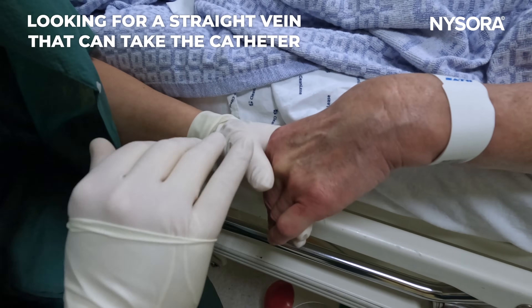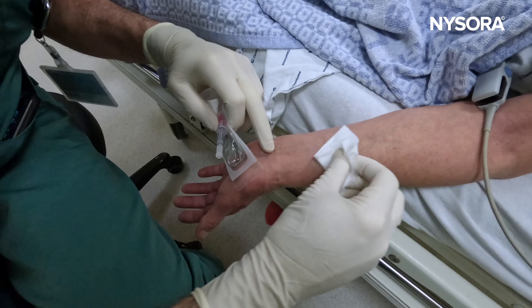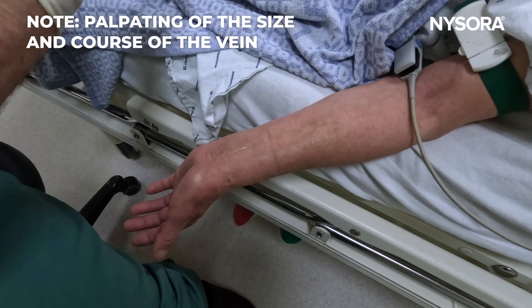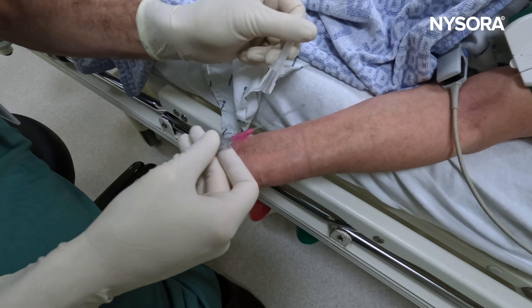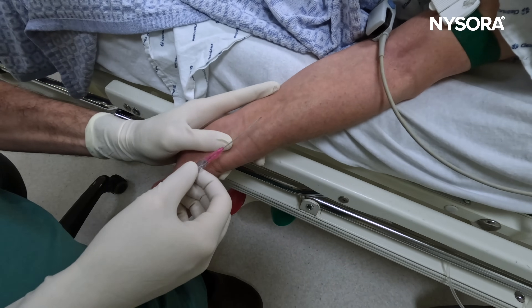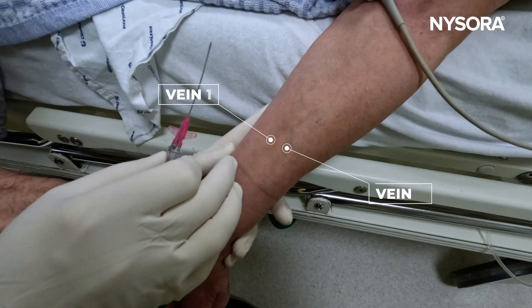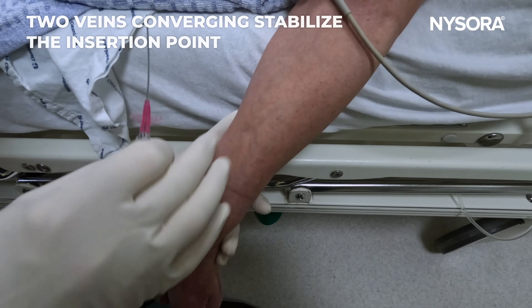We're looking for a straight vein that can take the catheter. So this is one option, though a bit trickier. I'm going to bend this first, which will allow me to lift the needle tip up. Here it will be essential to enter the vein fast. We can see two veins making a contributory junction, which makes this spot here ideal. The vein travels higher up, so this would be my spot here.